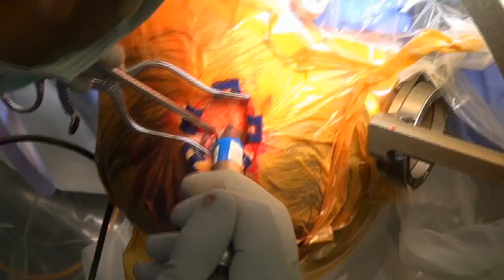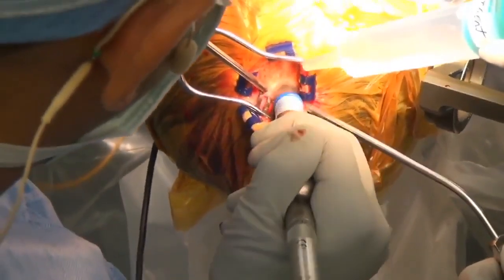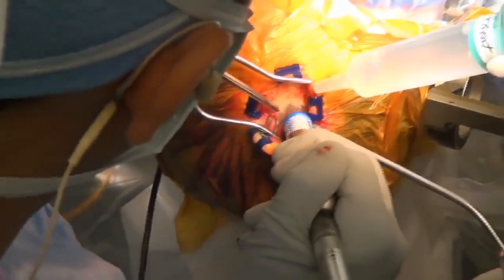Okay. All right, this is a perforating drill. Basically, is what's used to make that little hole about the size of a dime. And it's got a little clutch so that as soon as it meets no more resistance, it disengages and stops.